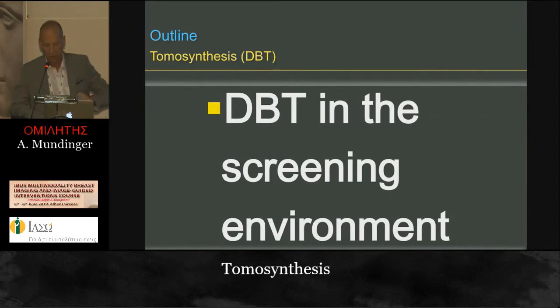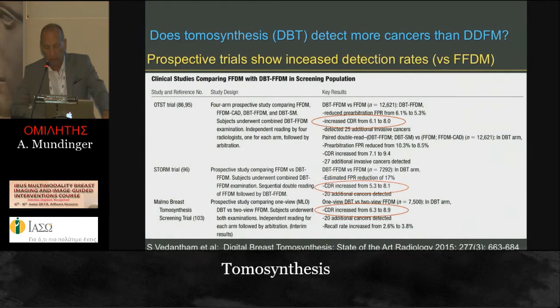Let's have a closer look at the screening environment and screening studies. And first, I would like to answer the question: does DBT detect more cancers than digital full-field mammography?